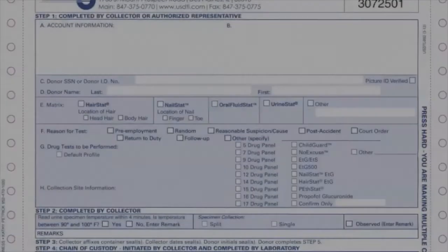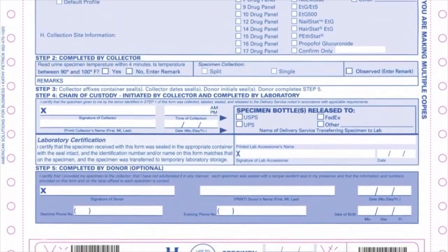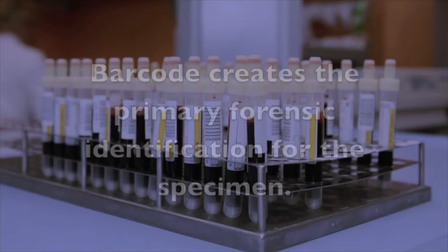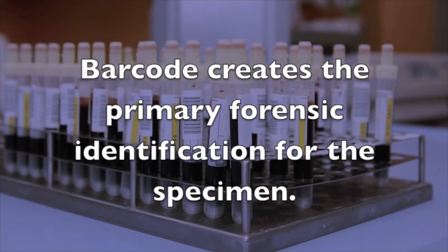It begins at the point of collection. USDTL provides 2 identical pre-printed barcode strips on the requisition form. One strip is peeled off and applied to the corresponding specimen container. This barcode creates the primary forensic identification for the specimen.